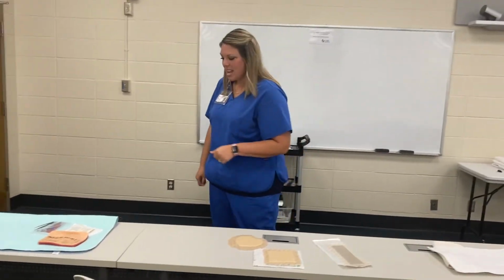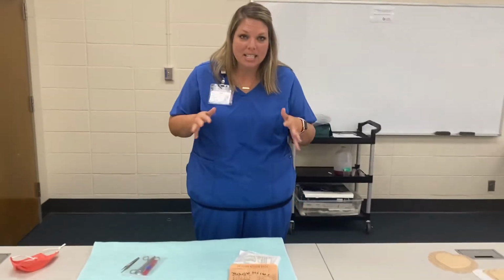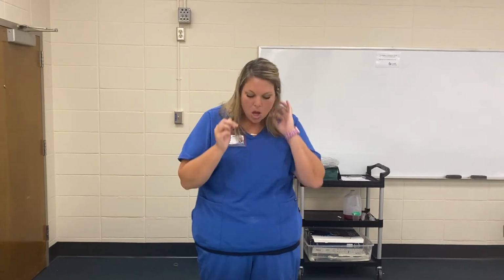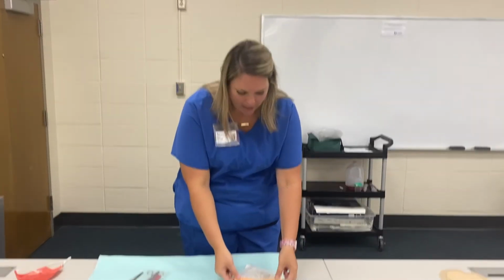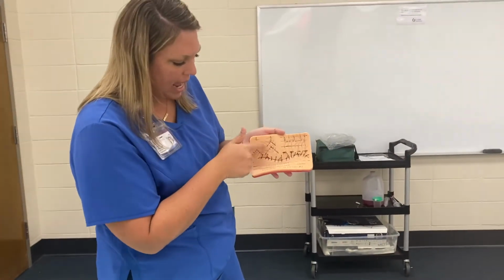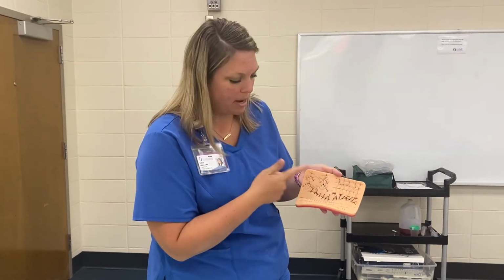The last thing of the video that I want to show you is the fun part that you're going to get to do in your stations. Students get really excited about this. We have suture removal and staple removal, okay? You're going to have one of these in your station that has staples on it and sutures, so we have enough for all of our friends. You're all going to get a chance to take out 2 or 3 of each.